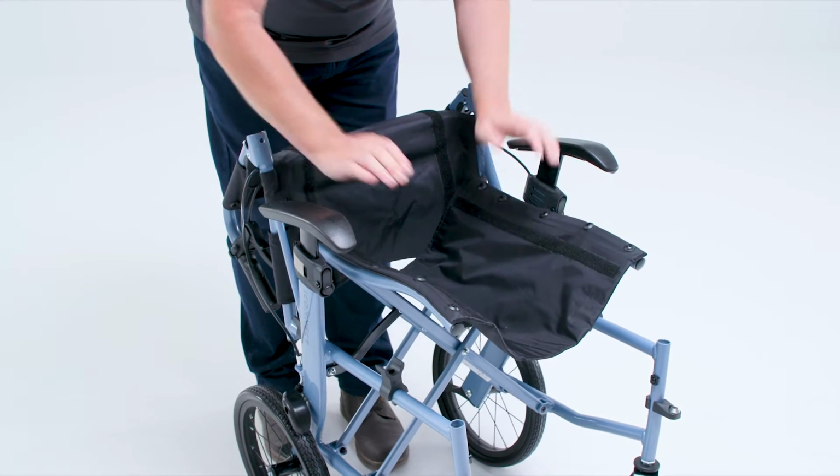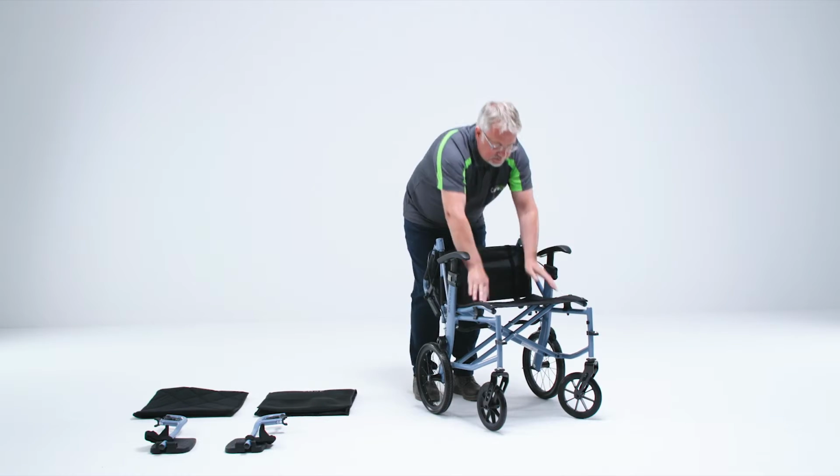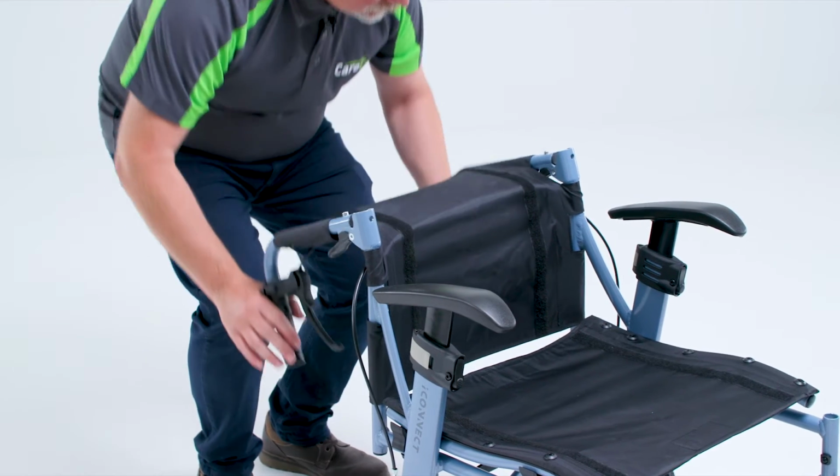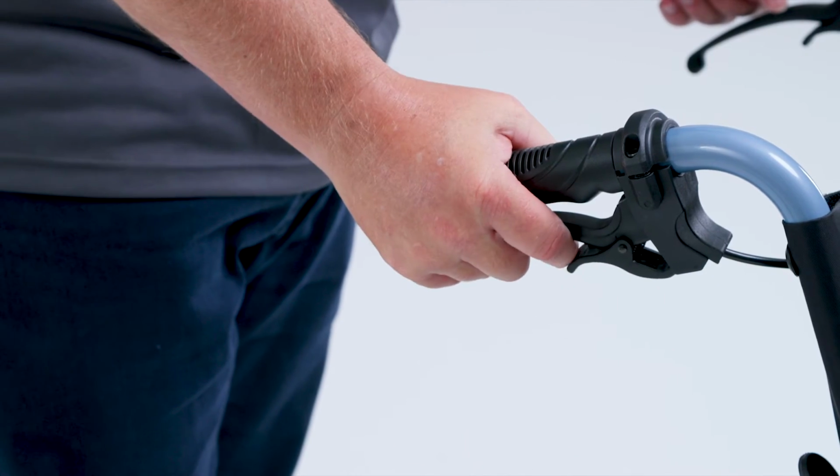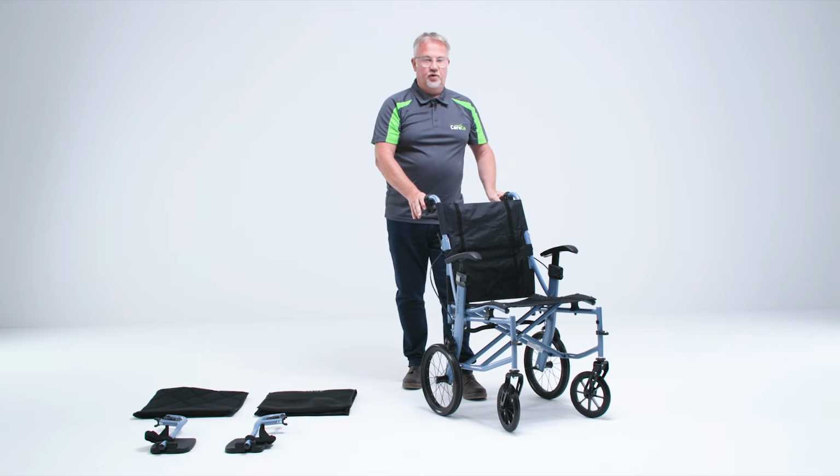Open out the wheelchair and press firmly on the seat. Lift up the backrest, that clicks into position, and I would advise to apply the brakes at the back just to stop it moving.